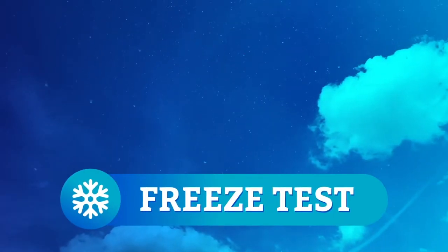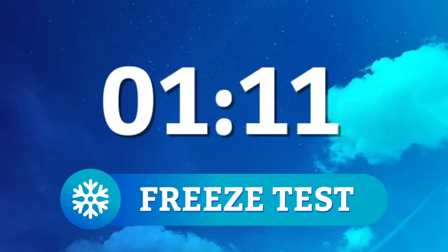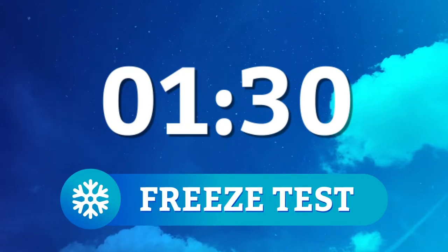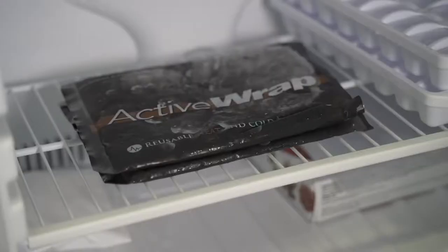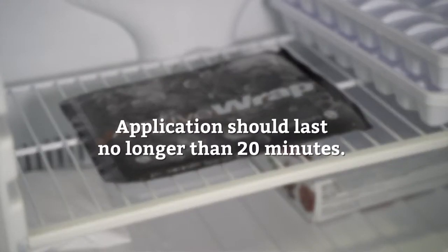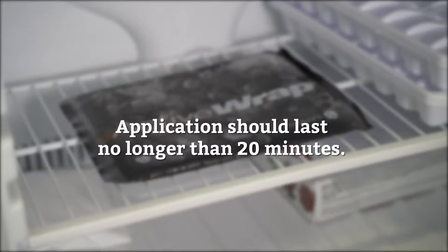During our freeze tests, the gel packs stayed cold for about an hour and 30 minutes — that's a super long time. The gel packs stayed pretty pliable even when we popped them in the freezer. A gentle reminder though: even if the cold pack stays cold for over an hour, each icing application should last no longer than 20 minutes.